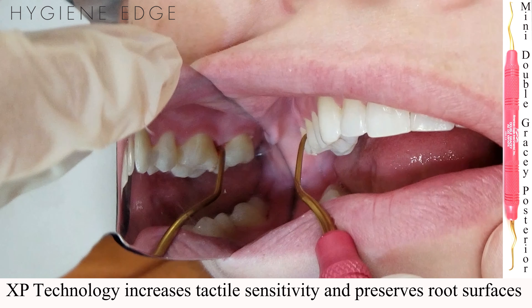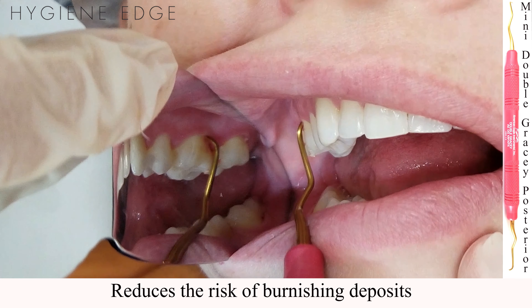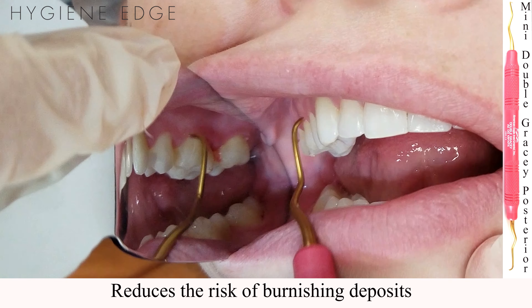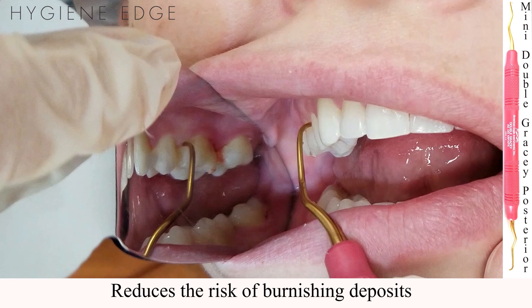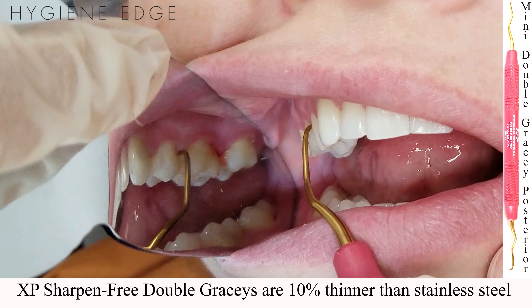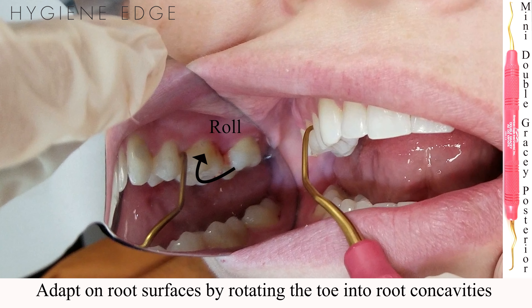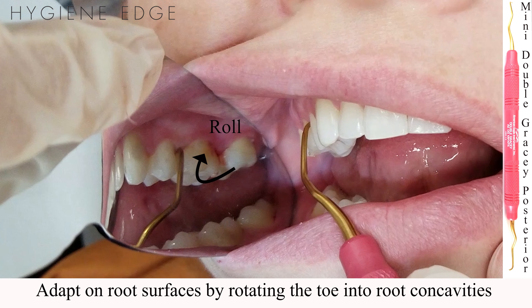Being able to use this stroke preserves cementum and allows for greater tactile sensitivity. It also reduces the risk of burnishing the deposit since you are no longer popping off the calculus. XP Sharpen Free Double Gracie Minis are 10% thinner than stainless steel, allowing for easier subgingival access. When working subgingival, remember that you are working in concavities, so the middle and heel of the instrument will be rotated towards the tooth next to it for proper adaptation.